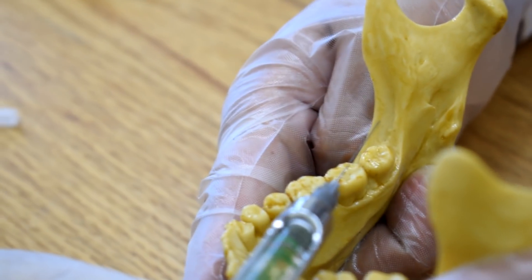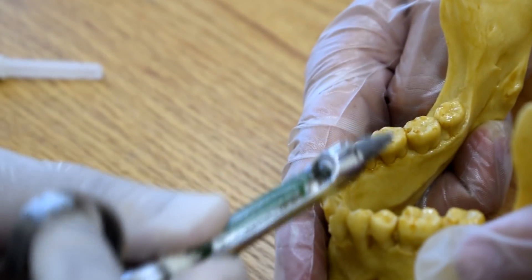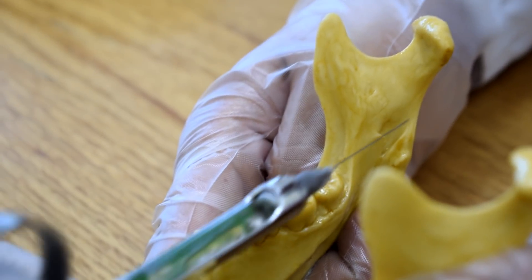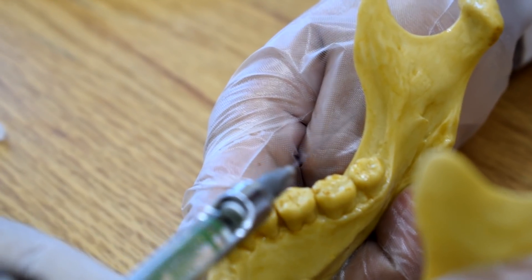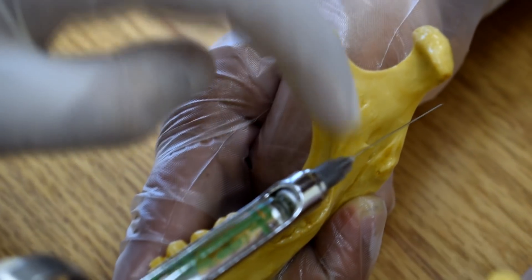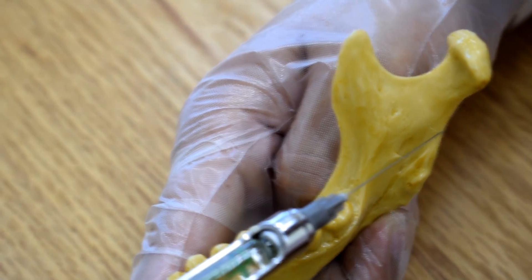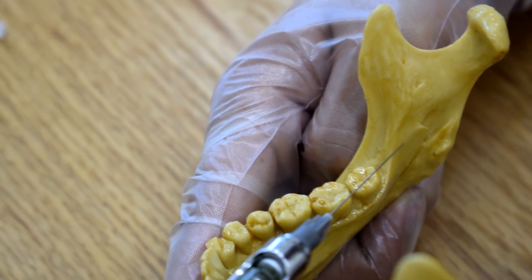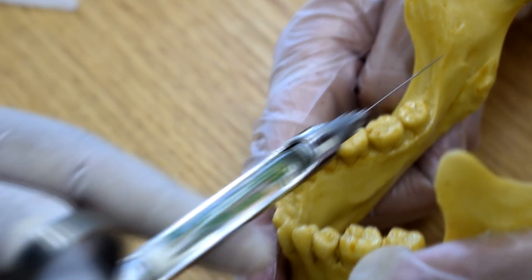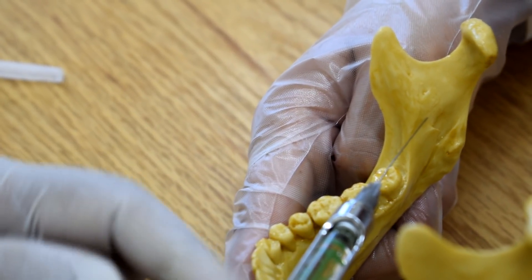Withdraw the needle and rotate — while rotating I will be more or less over the canine or incisors — then re-advance for the correct bone contact. If there is no bone contact — too medial injection — or too deep penetration with no bone contact, I have to withdraw the needle, redirect it passing over more or less the molars, and redirect the needle. If I had no bone contact and I injected the solution, I am injecting into the parotid gland.